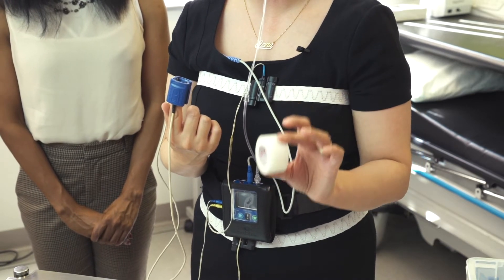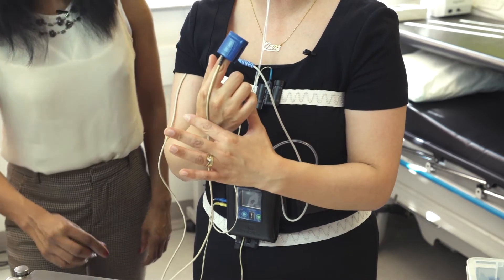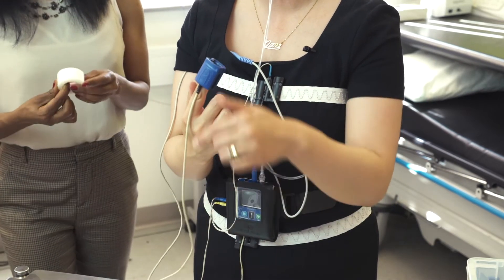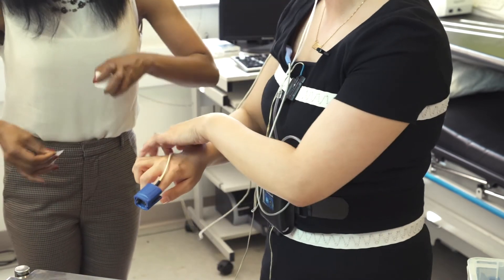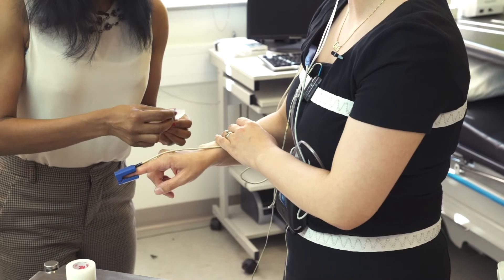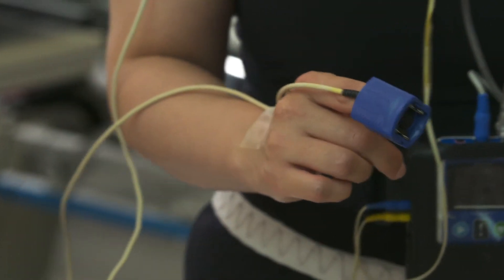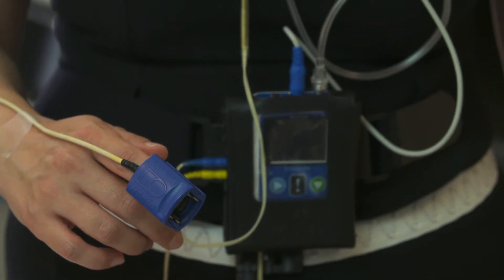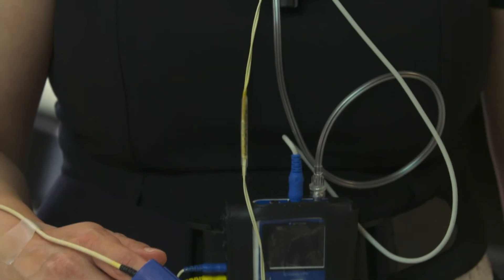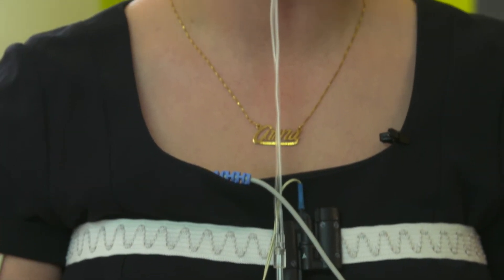With the tape we provided, again so long as you're not allergic to it, tape the wire to the back of your hand to help secure it in place, but avoid putting anything around the blue finger clip. This is how you should look when you go to bed. If anything comes off during the night or if you wake up and go to the bathroom, make sure you reattach it, but otherwise try and keep everything in place throughout the night.